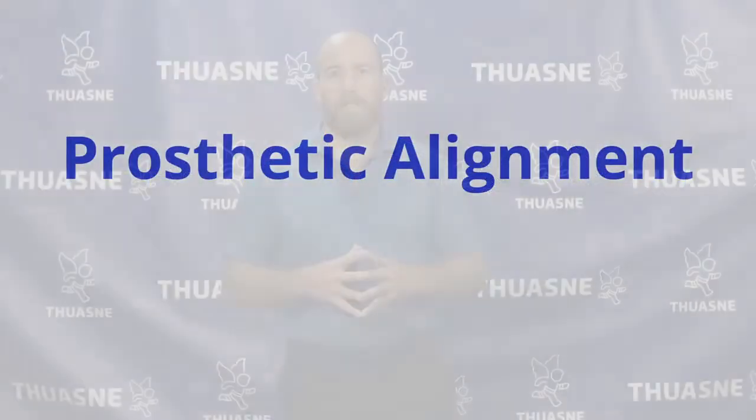For example, some patients might be flaccid, whereas others are very firm in their deformity or have a high degree of tone. All this information together will help us understand exactly the type of patient you're dealing with and then allow us to achieve the proper biomechanical objectives of the brace through determining the type of stiffness the brace needs for your patient. We want to take into account the cast and the alignment position. We want to also consider the clinical indications and our biomechanical objectives. The amalgamation of all this information allows us to precisely understand the exact category of stiffness you and your patient need.